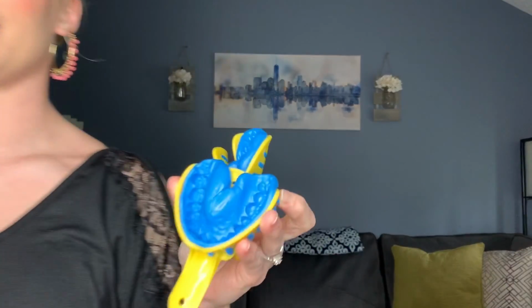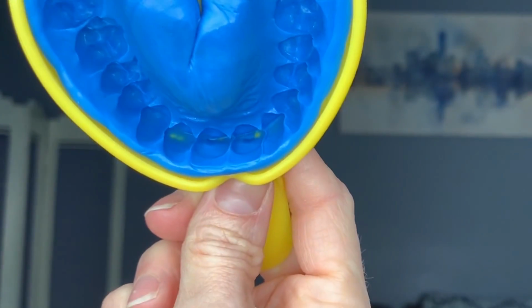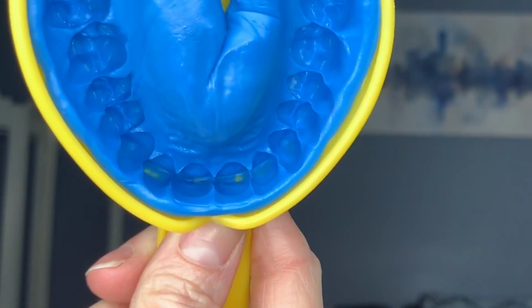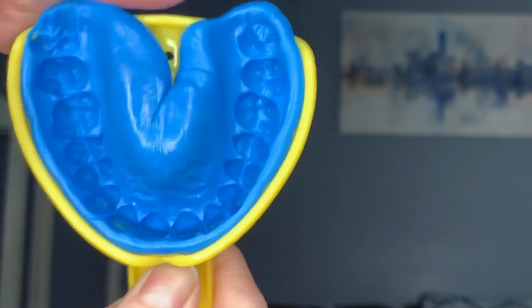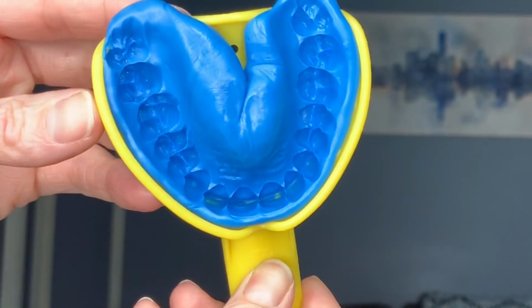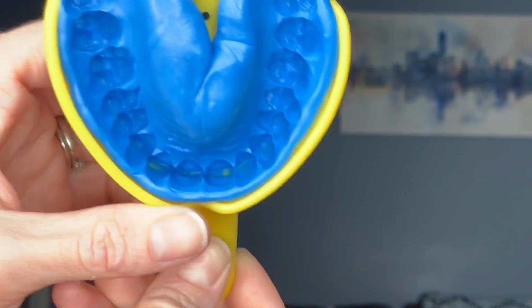So right here, as you can see on my uppers, I had broken through the putty. I had my teeth too far up in the front and too much pressure was applied. Now, what they want to see is all of your gum line. They do want to see that. So I did that very well. I just pushed it too hard in the fronts. So that messed that one up.